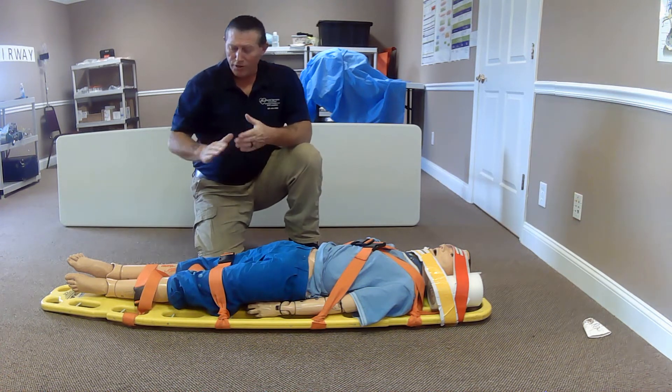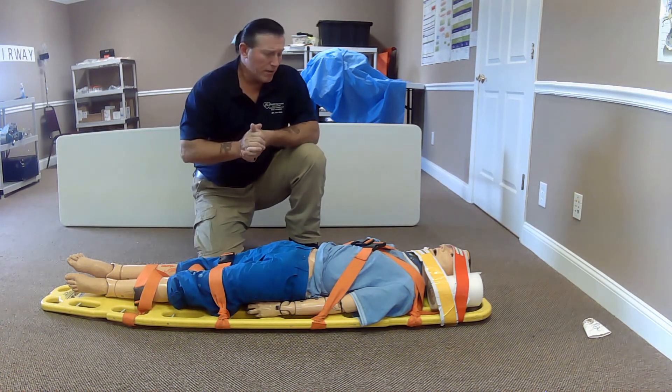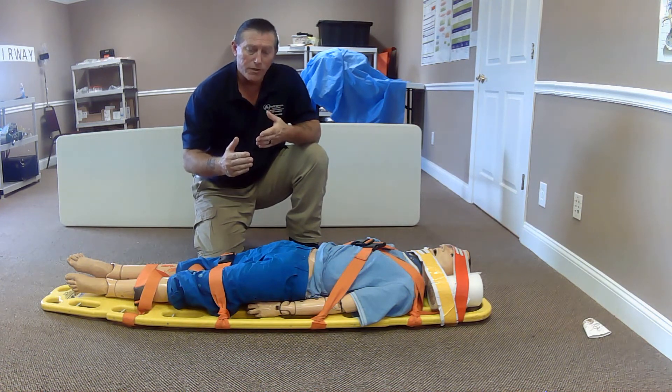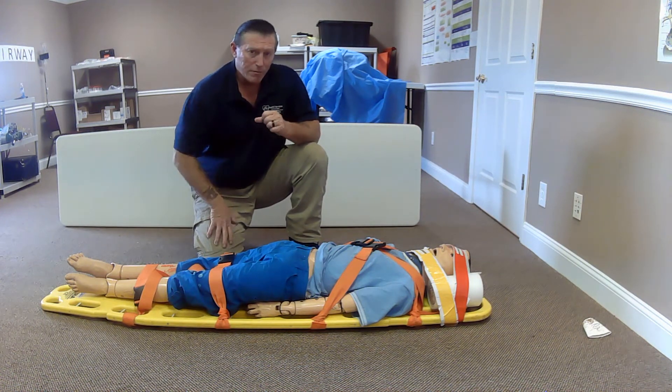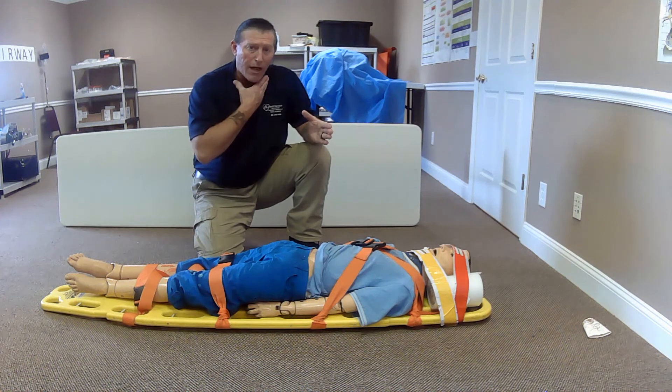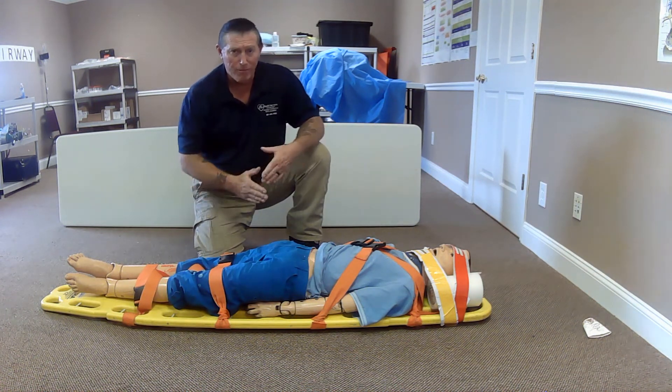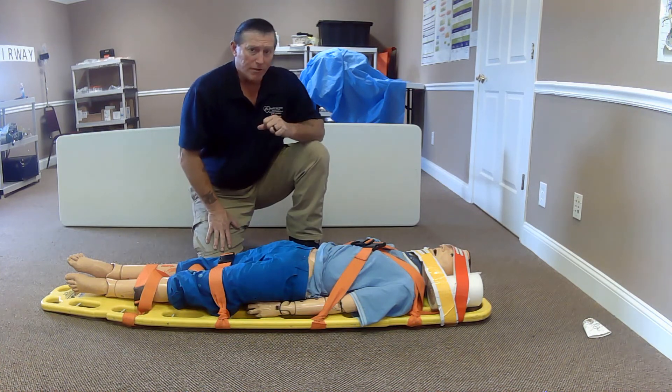I will now transport my patient to the hospital. It's super important to check your pulses and CMSs before you apply any type of cervical collar, and then do it again after you get the patient secured.